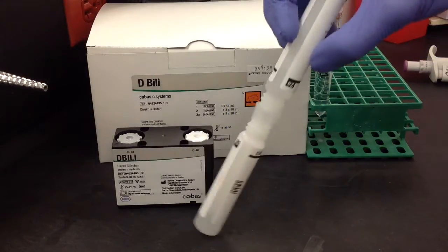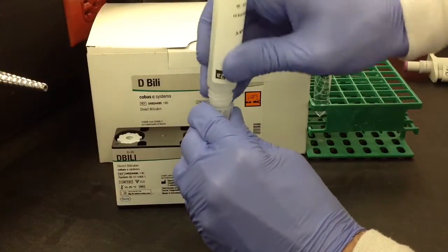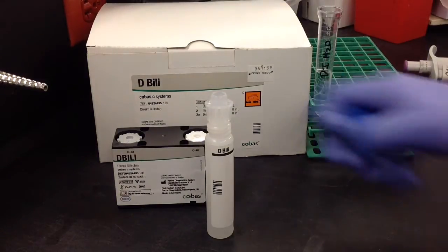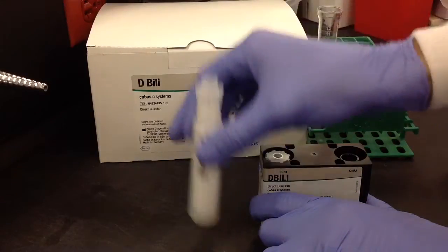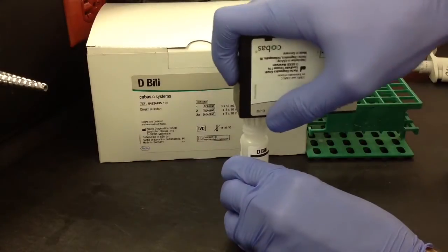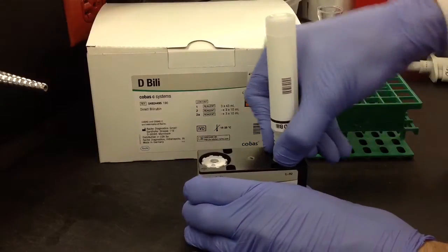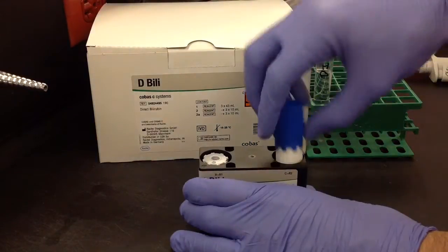After you're done mixing, just once again take all of the reagent and get it into one side, leaving the connector on the side that's full. Then go ahead and take your cassette and uncap the R2 side, and then connect it to your reagent. Tip it over and add the rest of that reagent to the cassette, making sure you get as much of it as possible. Then disconnect it, reconnect your cap, and you're all set.